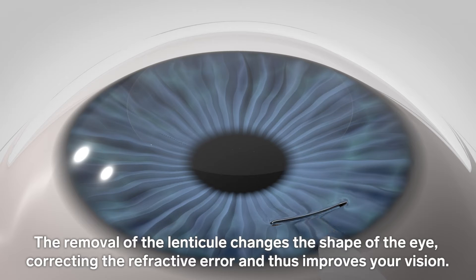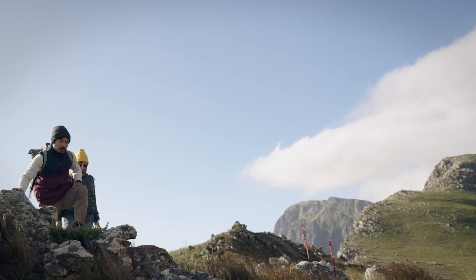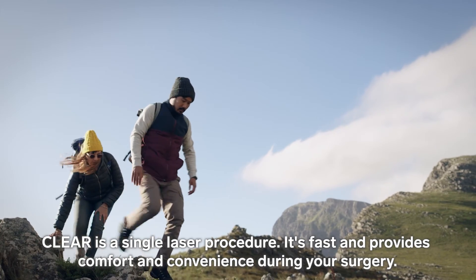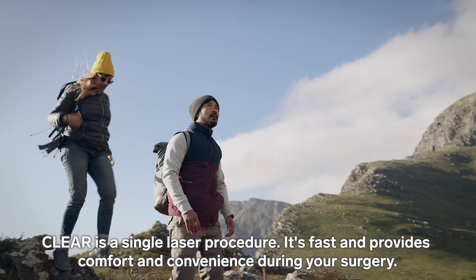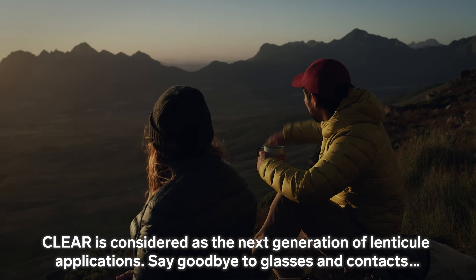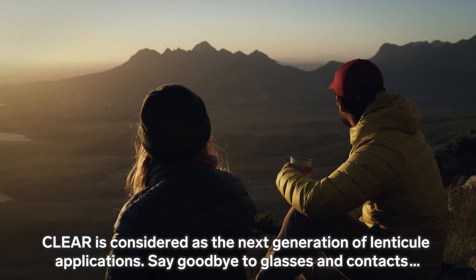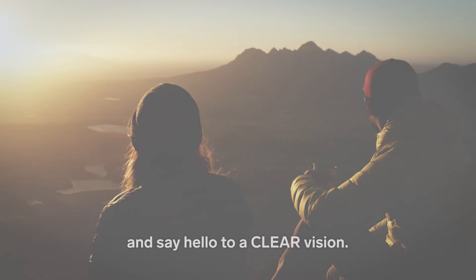The removal of the lenticule changes the shape of the eye, correcting the refractive error and thus improves your vision. CLEAR is a single laser procedure — it's fast and provides comfort and convenience during your surgery. CLEAR is considered the next generation of lenticule applications. Say goodbye to glasses and contacts, and say hello to clear vision.